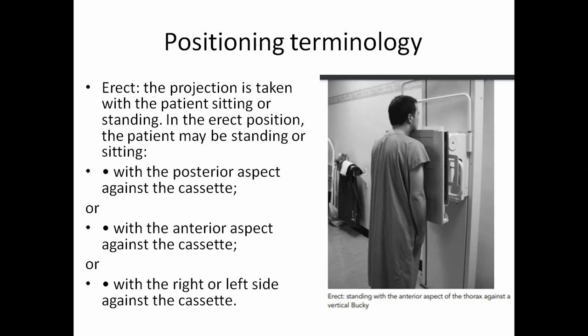So next comes the positioning terminology. There are positioning terminology and projection terminology. These are two things, so don't get confused, always, because whenever it comes to the question in the exams, a lot of times I have seen that if it is asked about positioning terminology, students will write about projection terminology. So these are two different things. Please concentrate on this. Now I'm going to talk about the positioning terminology.